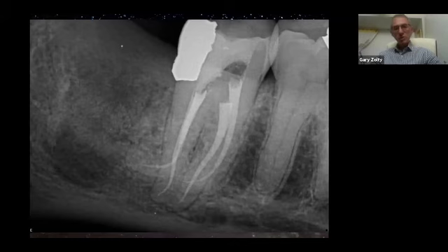And this tooth was completed with the blue heat activated file. And you can see there's beautiful control at the tip. They were long roots, probably around 23, 24 millimeters, which makes me quite nervous that we're going to have trouble near the tip. You can see we've got good control and good fill near the apex. This is what I'm talking about, a beautiful root treatment. I'm quite sure that when you see something tapered and looking like this, they've got a very good chance that they're going to be successful.